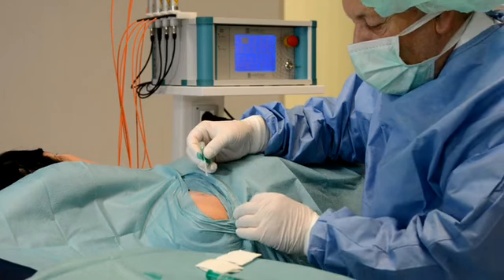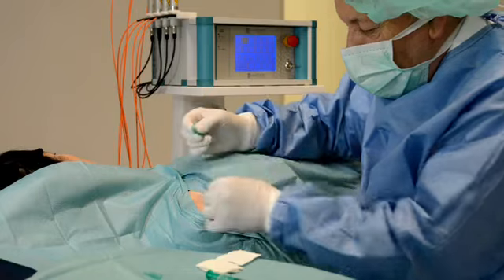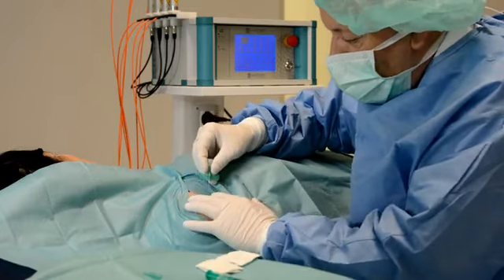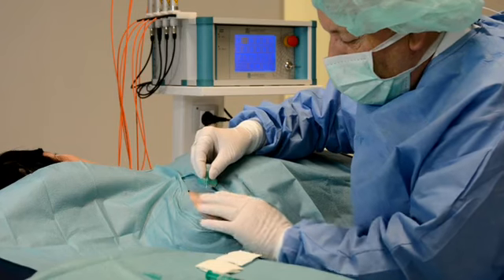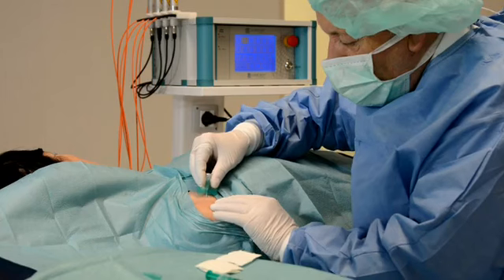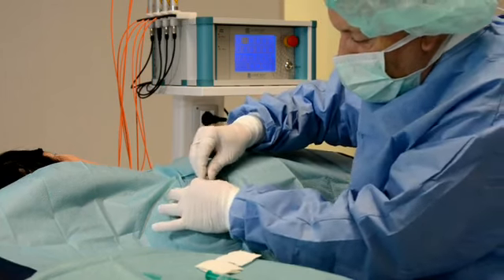This is absolutely pain-free. If you have bone contact with the needle, then remove it maybe 2 or 3 millimeters, so that it's comfortable for the patient. So the needle is fixed.